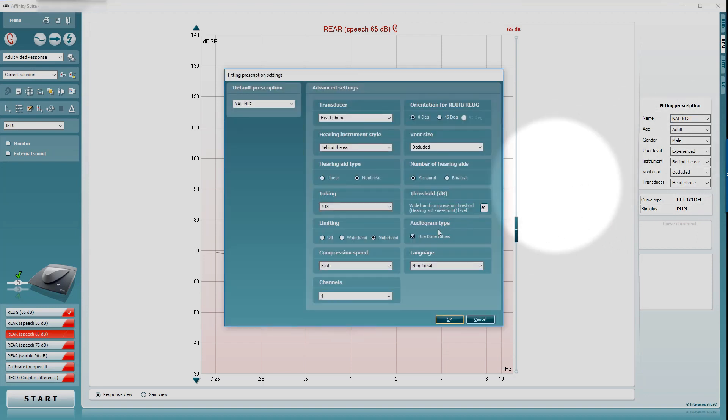We can go back in there and turn that off, or we could even change our prescription to look at what DSL might prescribe for such a loss. We won't do that in this scenario though.